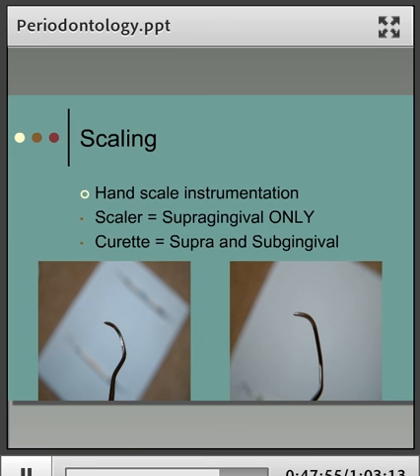And it's got two cutting edges. So that's why it's a bad idea to put it below a gum line. It's going to damage your soft tissues. Whereas a curette has a rounded tip or toe, and it's only got one blade, and in cross section it is half moon shape. So that's okay, done correctly, to bob into a pocket, for example, to clean it.